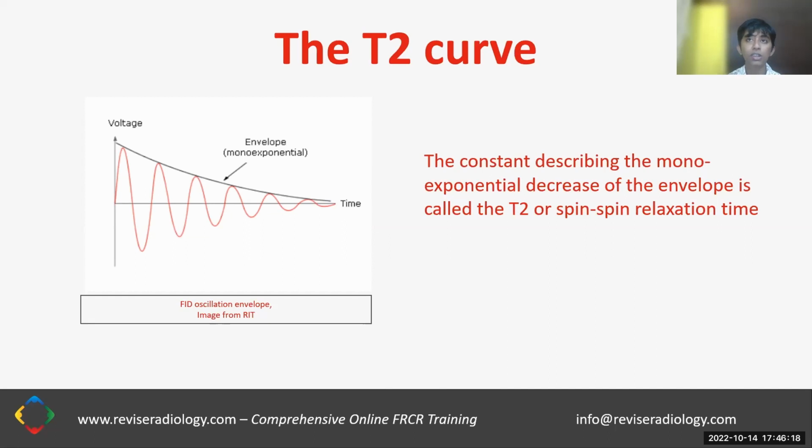So we talked about how all these protons are spinning, precessing at a certain angle to the B naught, and they are acting like a big magnet would spin. So we know how to tip over spinning magnets. We just have to apply an oscillating field to them. So what we did is we applied an oscillating field at 90 degrees. This oscillating field pushes and pulls the magnet until it's spinning in the 90 degrees direction. And at this point, the transverse magnetization is 100%.